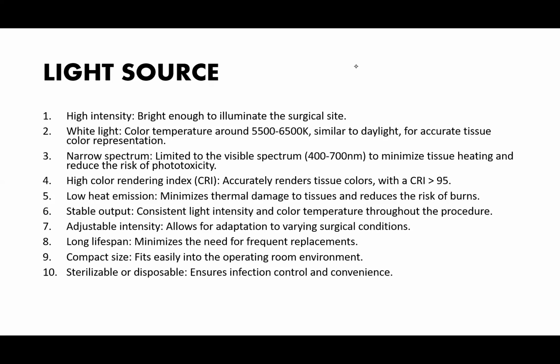So it is very important you understand the basic principles guiding all the steps, from the instrument itself, in fact from patient preparation, handling of the instrument, intraoperative and postoperative principles, and some specific procedures we are going to describe.